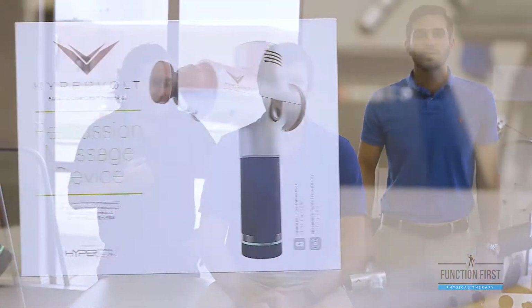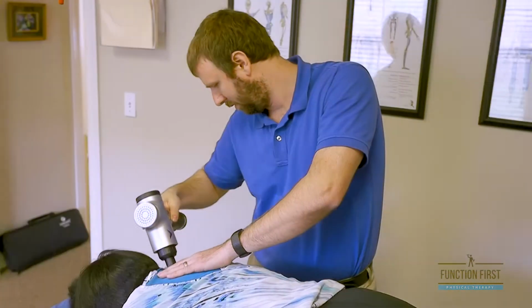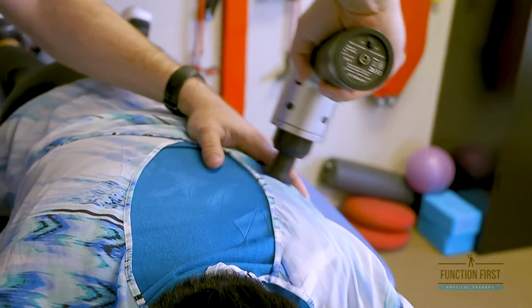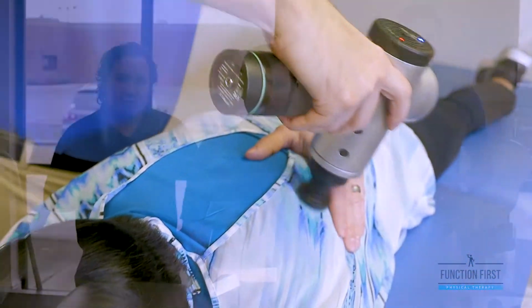Hello. Today we're going to be covering the Hypervolt. It's a unit we use in clinic quite a bit. We find it's very good for increasing circulation, giving good myofascial release prior and post treatment to really loosen those muscles and get them ready for the therapy, whether it be activation, local motor control, or even the myofascial strengthening. Matt is going to show the Hypervolt in action with some of the different tips we have.